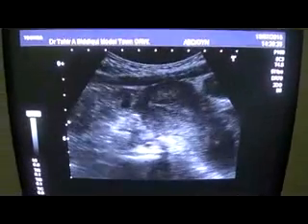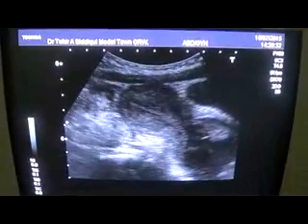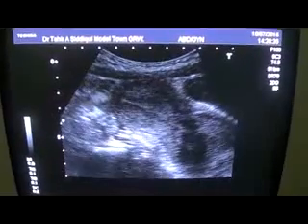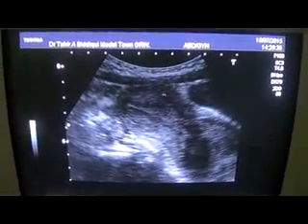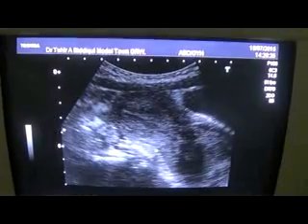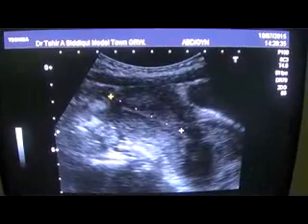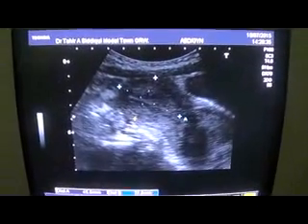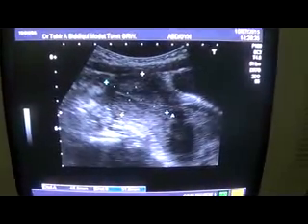This is our 12-year-old female child. What I am showing you is the fundus of the uterus, body of the uterus, the posterior lip of the cervix, and the anterior lip of the cervix. We are measuring 4.5 cm in size and 3.15 cm in anterior-posterior diameter. This size is acceptable and normal.